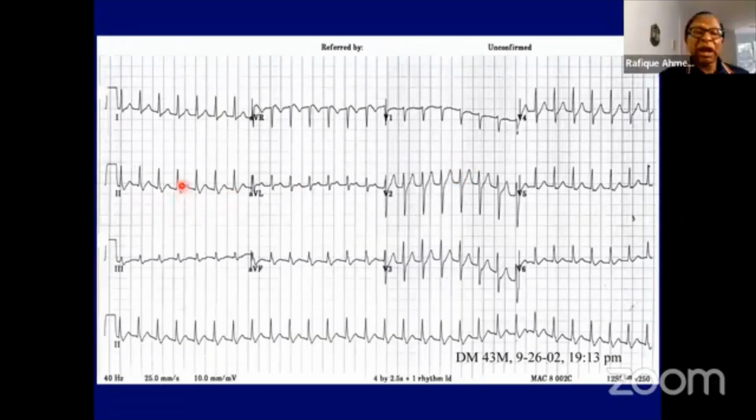There is something after the QRS complex. Even if you could not see anything, if you look at lead V3, you cannot see any P wave. But if you see lead V5, there is a notch. In V2, maybe there is something which normally you should not see. So this is AV node reentry. Absolutely.